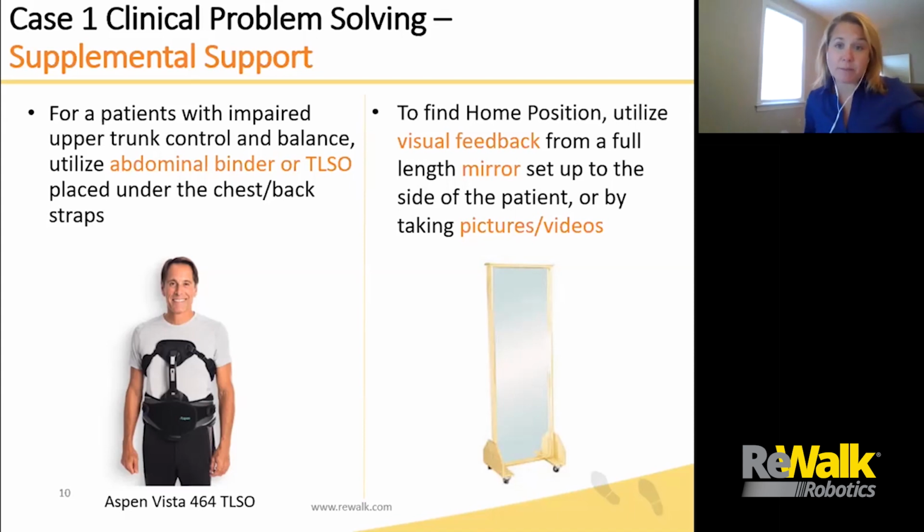And sometimes some patients will use it throughout their usage with the ReWalk, but especially early on to help patients while they're not maybe as coordinated as they're going to be with the crutching and whatnot. Something like this can definitely help.